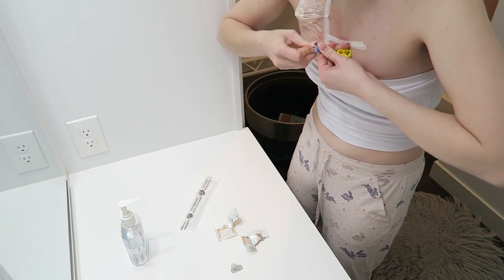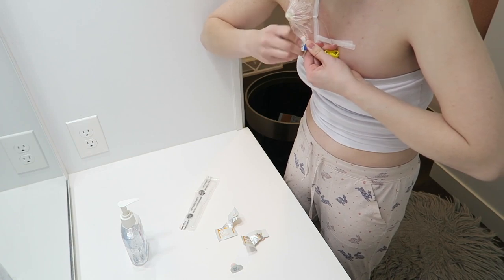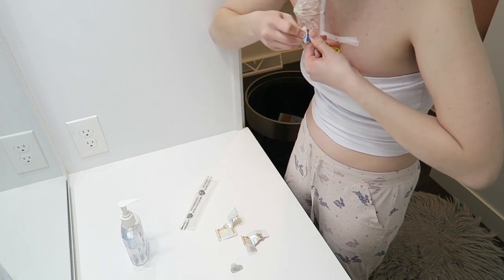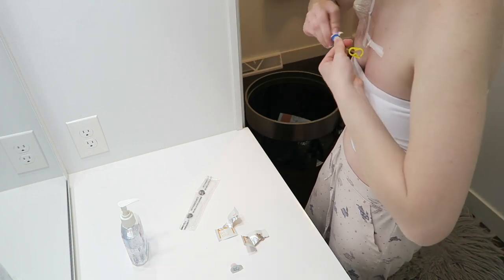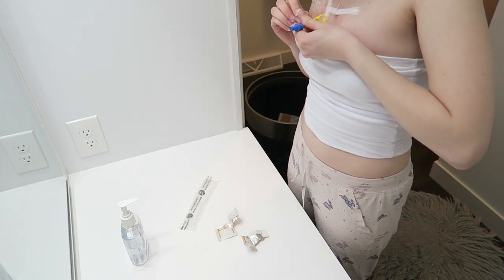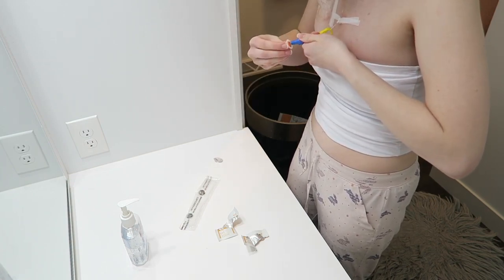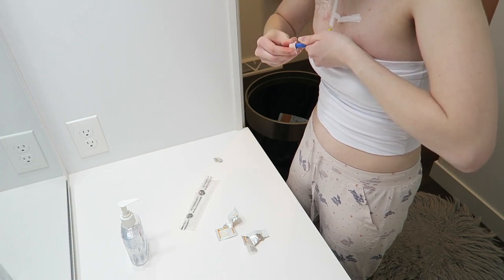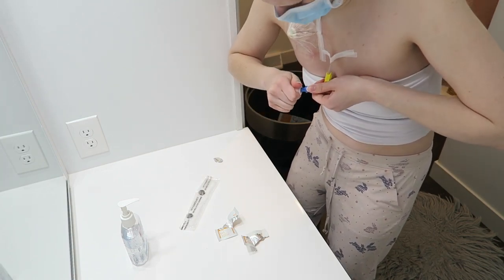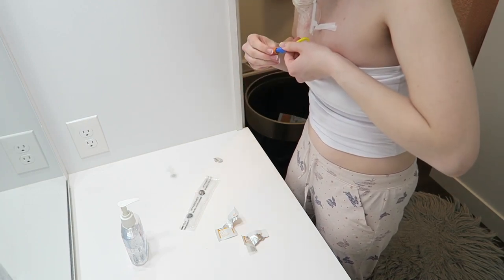Some people might think this is excessive, but when it's coming down to your health and your infection rate and your chance of getting sepsis, you can never be too careful. So you always want to be as careful as possible. So now that that's clean, we're actually going to put a clean swab cap on top. Swab caps contain alcohol, which will keep the end of your line clean. There's also a type of cap called a Curos cap, and that contains chlorhexidine. So now I am done accessing, I can go ahead and take my mask off, but that's basically it.